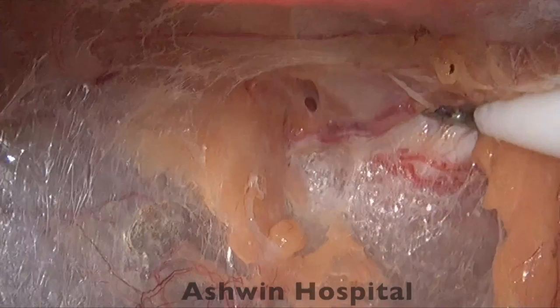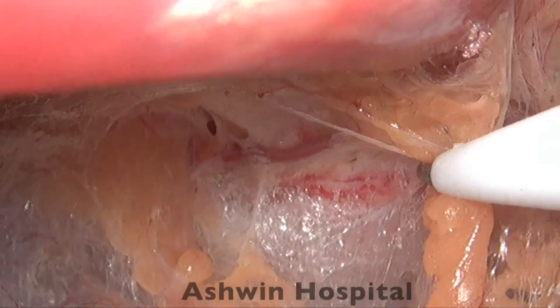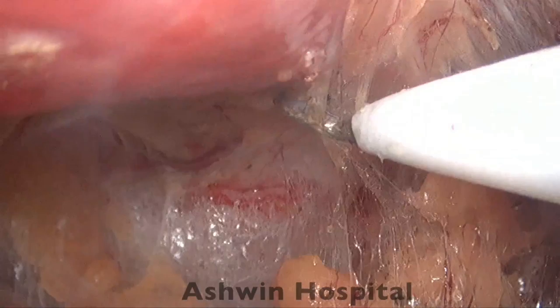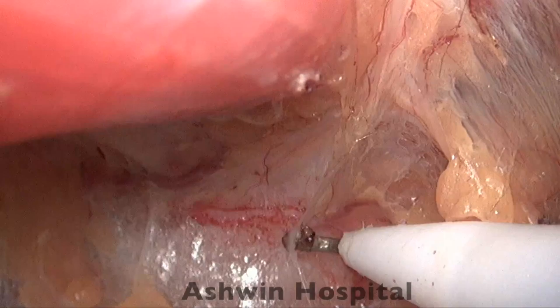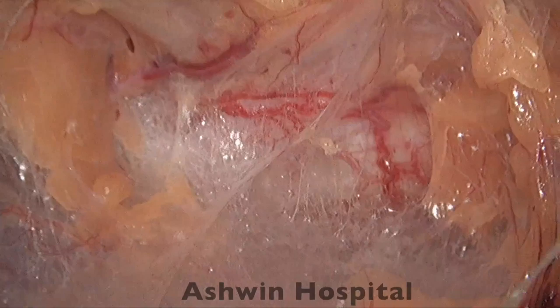So now we are able to appreciate the Cooper's ligament, and once that is seen under vision, we can just continue to carry our dissection and move towards the opposite side as well, so that the entire arch of the pubic bone and the Cooper's are clearly visible. You can once again see there's a thin fascia still covering, and that's why we are not able to see the Cooper's very clearly. So once that is released, you can see the bone is becoming more and more exposed.